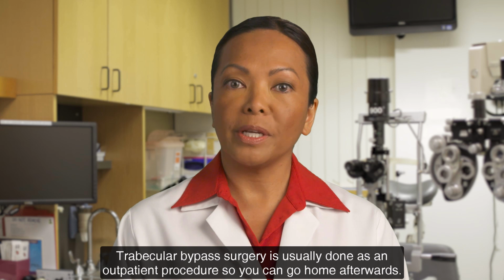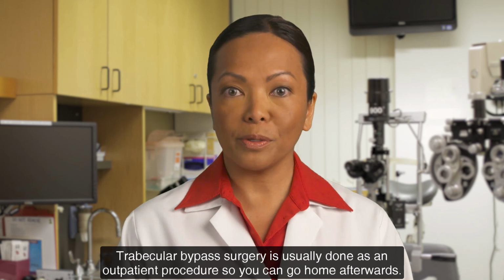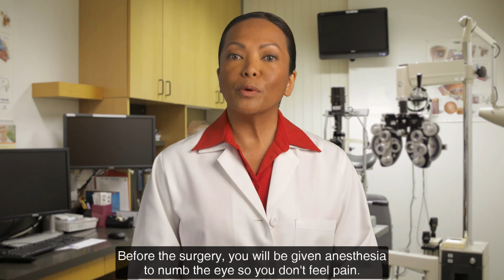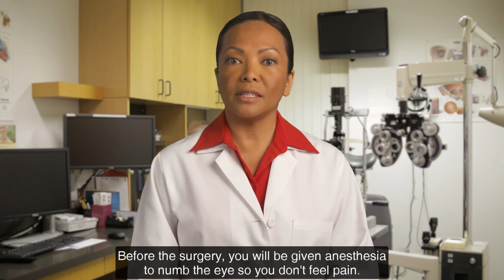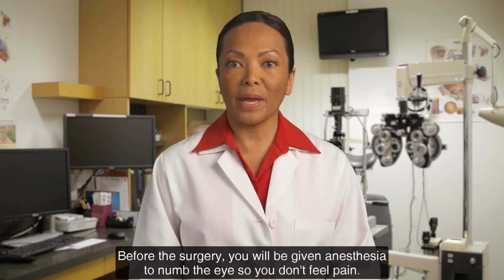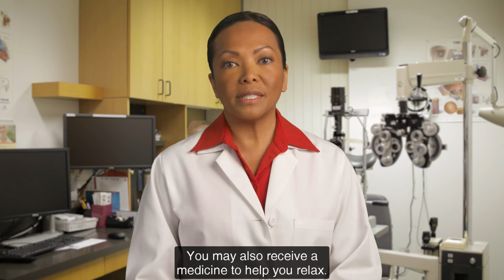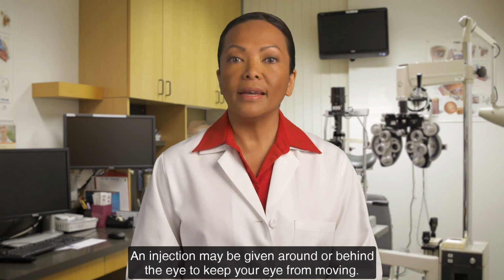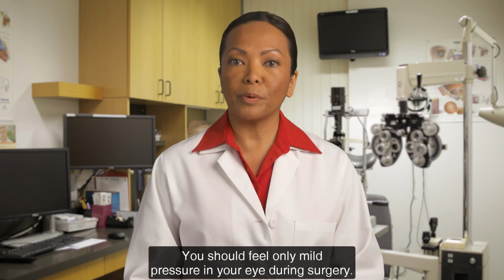Trabecular bypass surgery is usually done as an outpatient procedure, so you can go home afterwards. Before the surgery, you will be given anesthesia to numb the eye so you don't feel pain. You may also receive a medicine to help you relax. An injection may be given around or behind the eye to keep your eye from moving. You should feel only mild pressure in your eye during surgery.